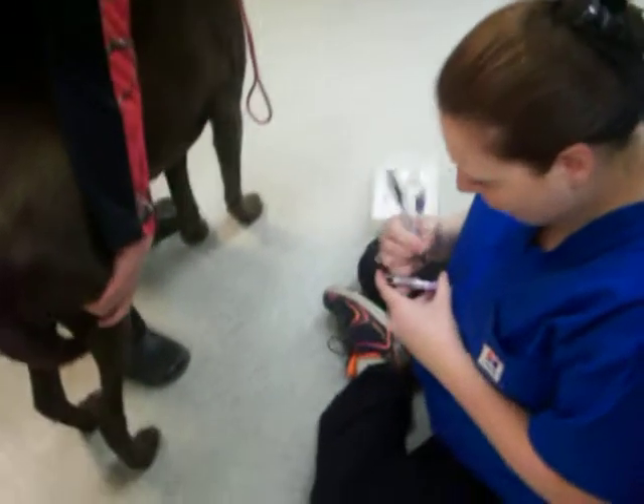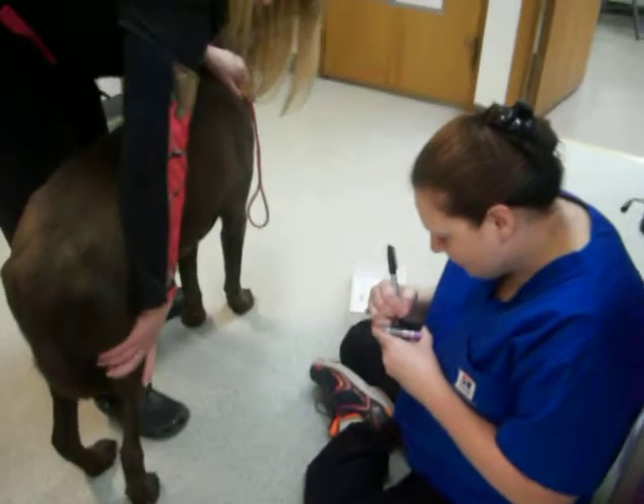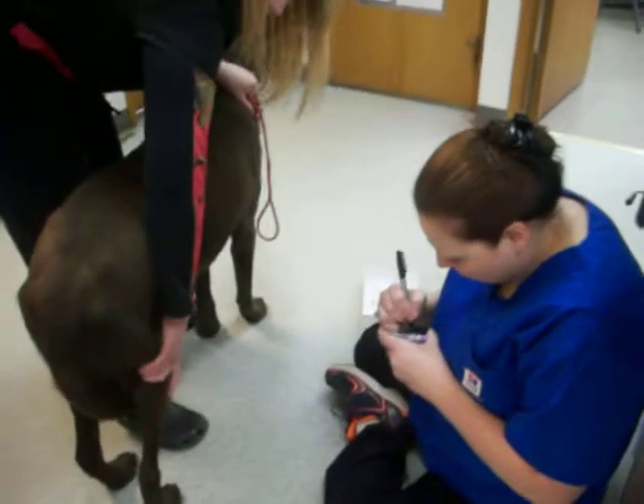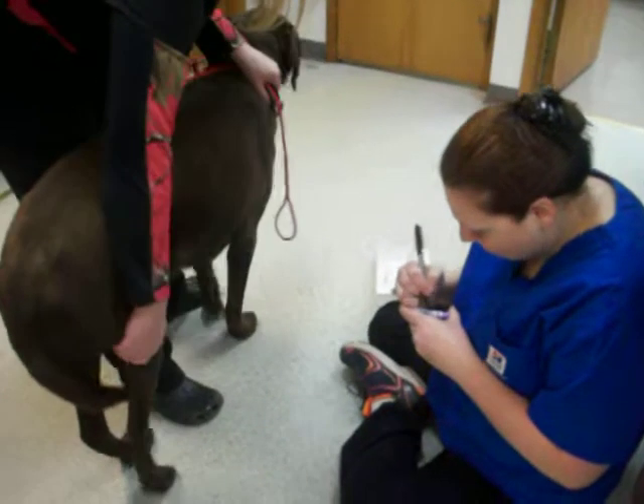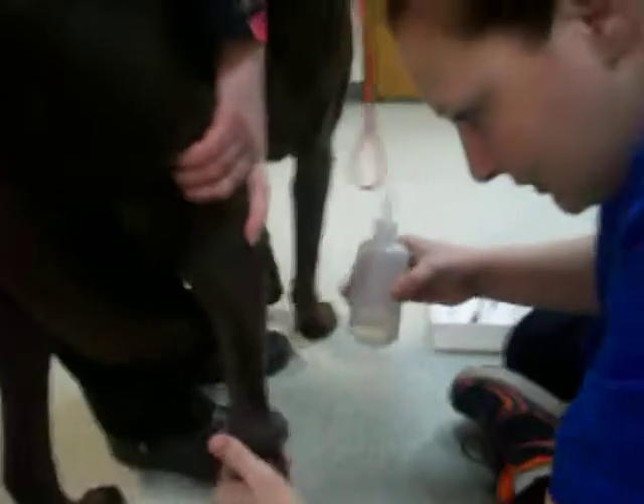This is task 22. We're going to go ahead and draw from the saphenous vein here on season. We're going to label our tube and put today's date and his name. Tanya's going to go ahead and pull it off for her. We're going to put some alcohol on there so we can help the vein stick out.